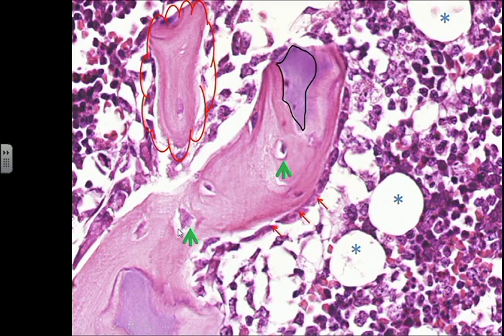These are pieces of bone, and because they don't have any blood vessels inside, they are trabecular bone. When we look at it, it's all formed of pink material that's more or less homogeneous. Homogeneous means it's stained very evenly without spaces. But then someone can say, well, I see areas like here and in here where the pink staining changed to become purple.